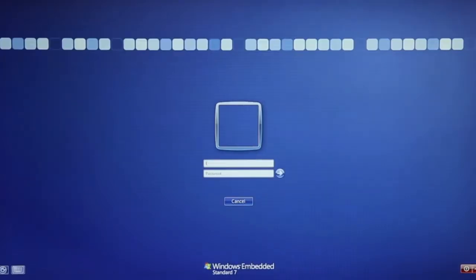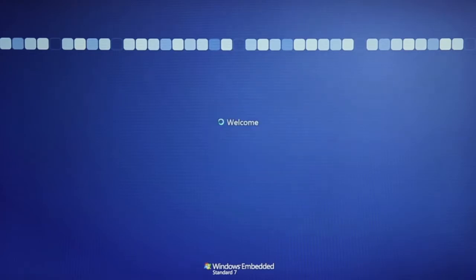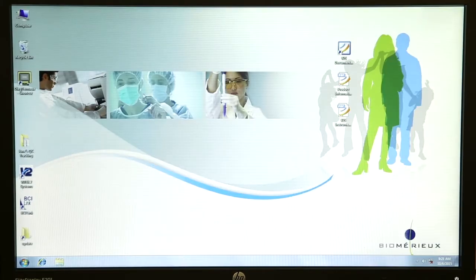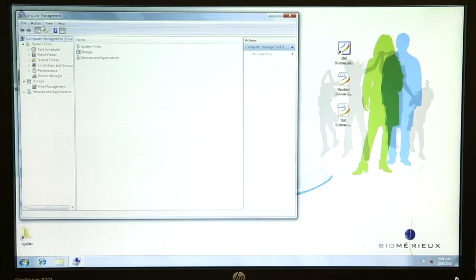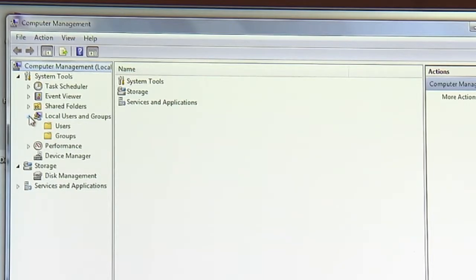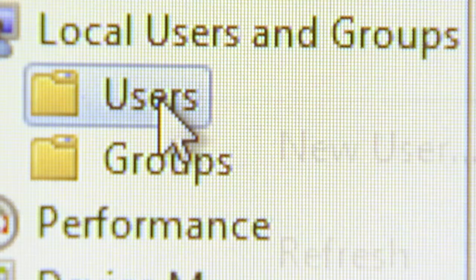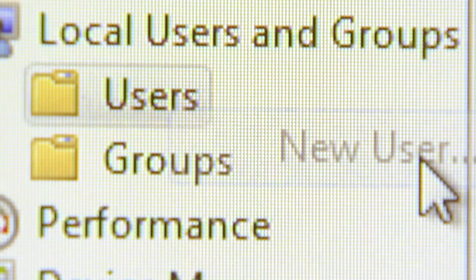Log in to the Windows 7 operating system using an account with administrator privileges. From the Windows desktop, right-click on the computer icon. This icon can usually be found in the upper left corner of the screen. Click Manage to bring up the computer management window. In the navigation tree under System Tools, click the arrow symbol to the left of the Local Users and Groups folder to open it. In the navigation tree, right-click on Users. Click New User.